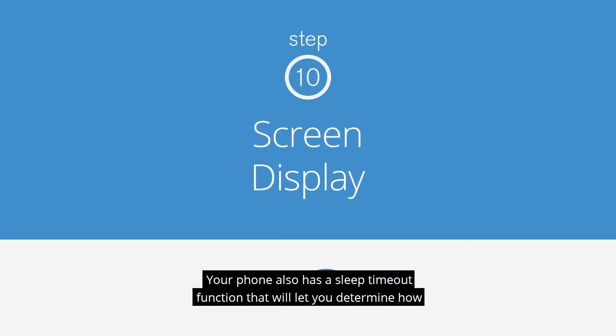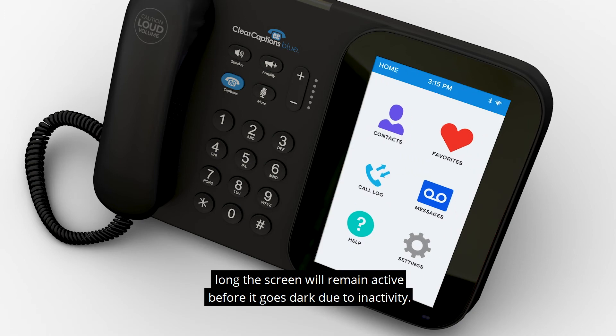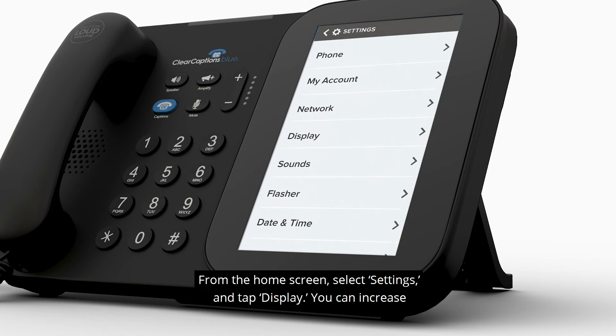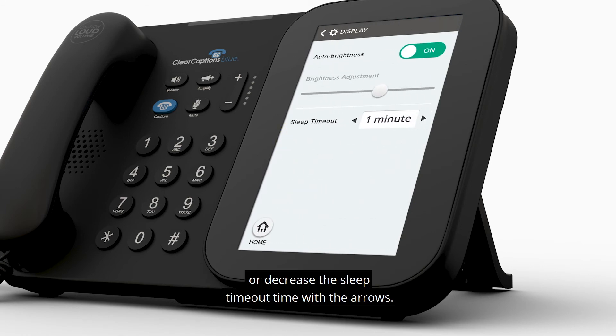Your phone also has a sleep timeout function that will let you determine how long the screen will remain active before it goes dark due to inactivity. From the home screen, select Settings and tap Display. You can increase or decrease the sleep timeout time with the arrows — increments start at 1 minute and can increase up to 20 minutes.